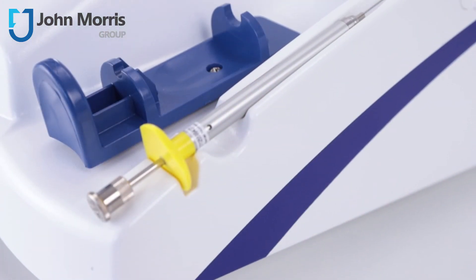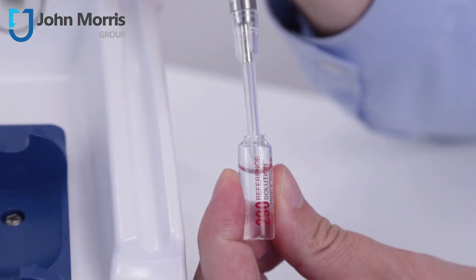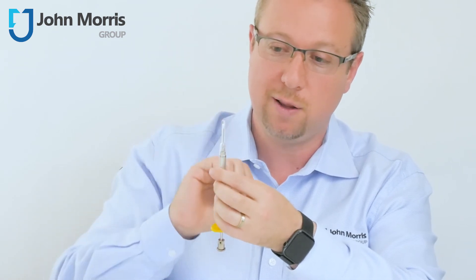All Advanced osmometers are provided with a pipette similar to this one. We're going to take a 290 standard and show you how the unit works. We're going to pipette that standard up, and as you can see at the end, that's fairly clean — no liquid around the outside of the pipette tip.